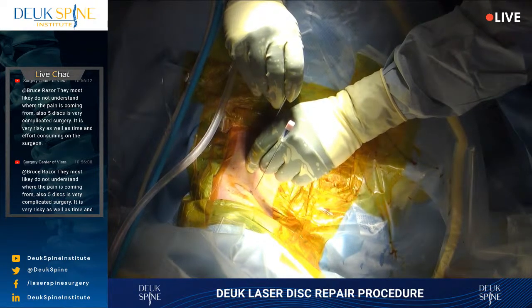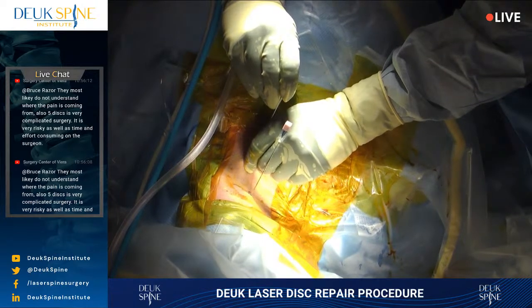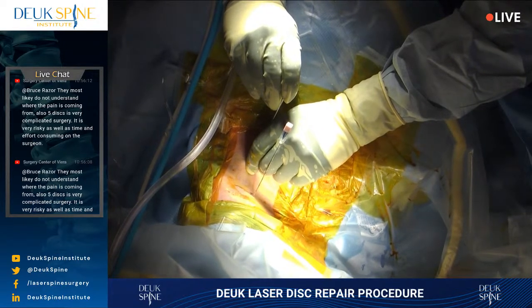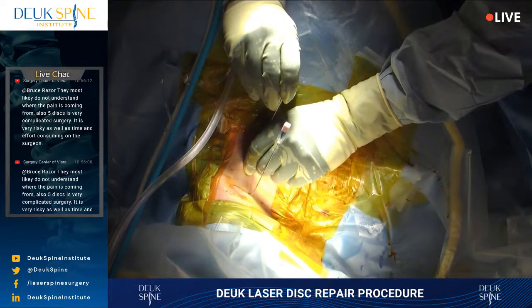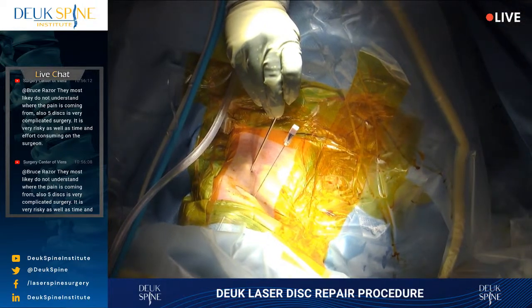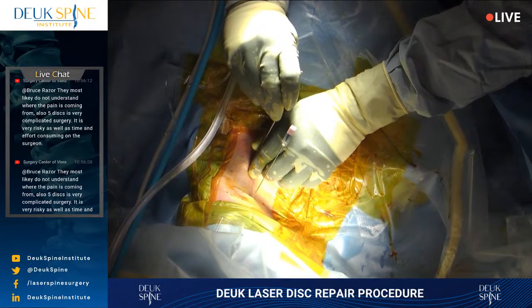Shot. Just about out. And give me inline traction, please. Keep the head straight, looking straight up. Don't rotate it, and keep it slightly extended. All right, so I am out. Shot. I can feel it. And now I got to march it. And I got to stay in the middle. All right, so I need to make sure I'm in the middle first.